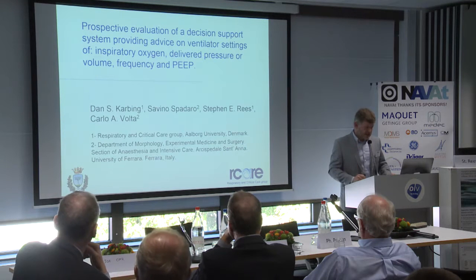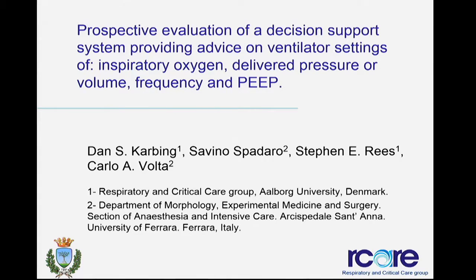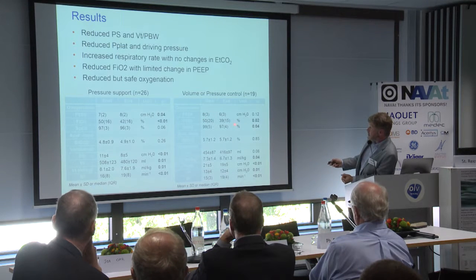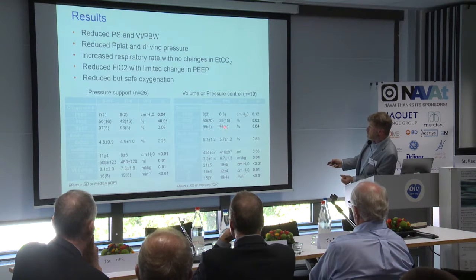We did a similar study in Italy, again, relatively small numbers, but this time with the system with PEEP. In Italy, it appeared they over-oxygenated the patients, and we could reduce inspired oxygen on average by 10% without significantly inducing an oxygenation problem.